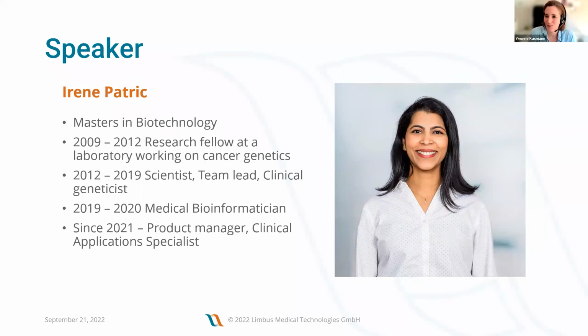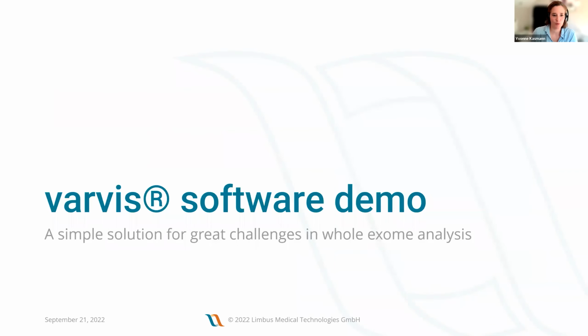So I'm introducing to you Irene Patric. She has a master's in biotechnology and many years of experience in the field of genetics and research, and also in clinical settings. And she joined Limbus almost 2 years ago, and she's product manager and clinical application specialist. So I will hand over to Irene for the varvis software demo. Thank you, Yvonne.